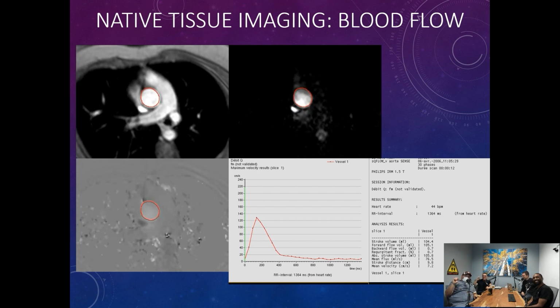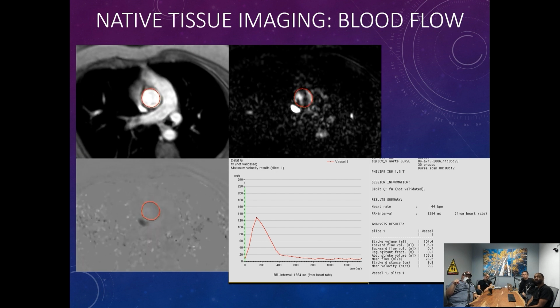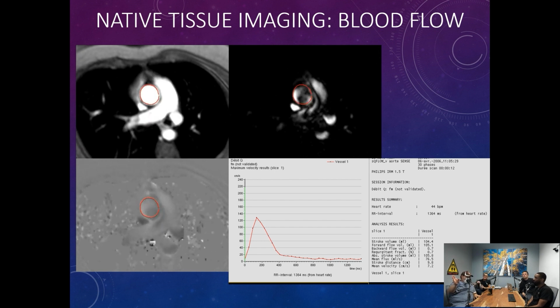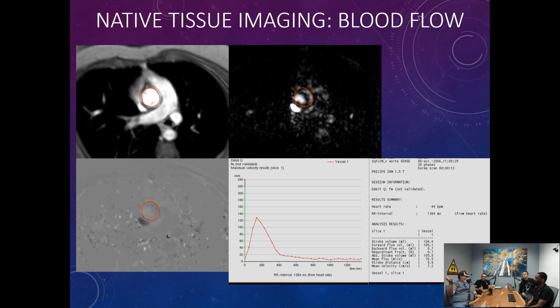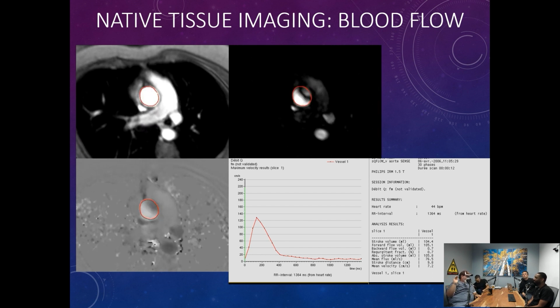I'm going to use this as an opportunity to talk about 4D flow. And so when we're talking about phase contrast imaging, what we're doing here is when we set up our flow gradients, our phase gradients rather, to look at flow, basically what the tradition has been is we can look in one direction. Head, foot, left, right, up, down, whatever we want to set that direction to. But we can look in one direction.